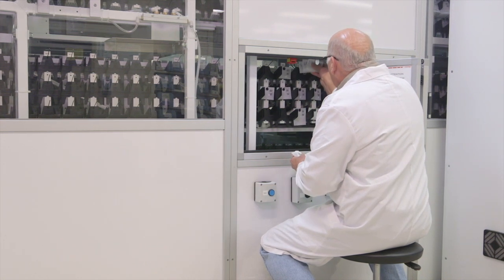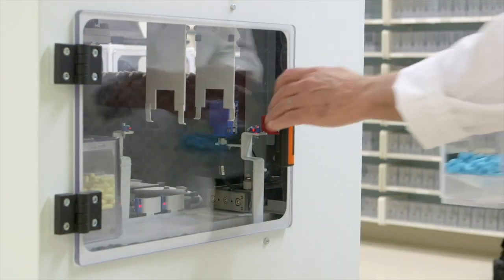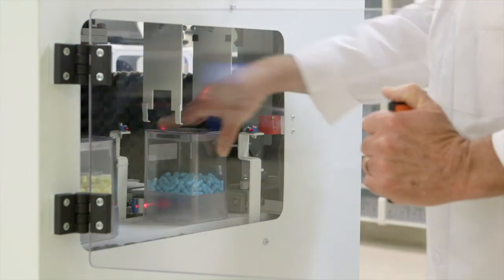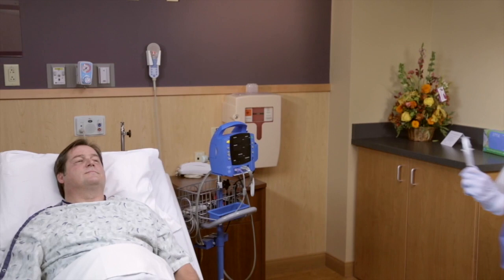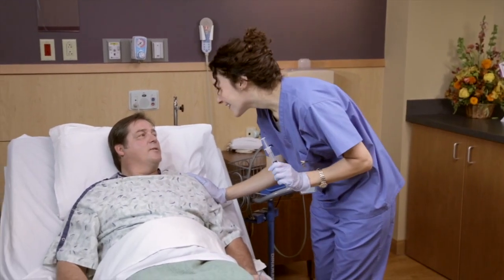The automated return of unused medications and credit to the patient account saves time by eliminating manual data entry and extra process steps. Pill pick offers unparalleled accuracy, control, and traceability, providing greater safety at the point of administration.